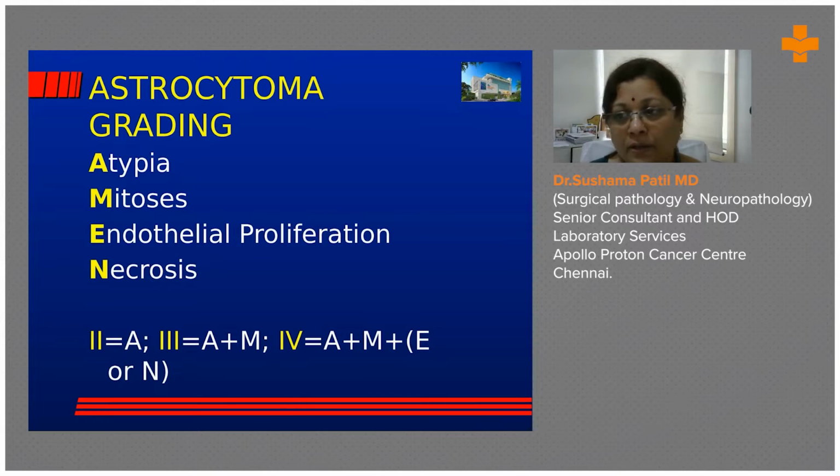For astrocytoma, the number of mitoses is not fixed. In a needle core sample, if I find even one mitosis, I tend to favor an anaplastic grade, because the random chance of getting one mitosis in a diffuse glioma is 1 in 100. Even when you give me the entire sample, I have to struggle to find one or two mitoses in a grade 2 glioma. But when even a random biopsy pulls up a mitosis, it means there must be a lot present. But I will always give a disclaimer saying that, sir, I am seeing 1 or 2 mitoses, so I am favoring anaplastic grade.